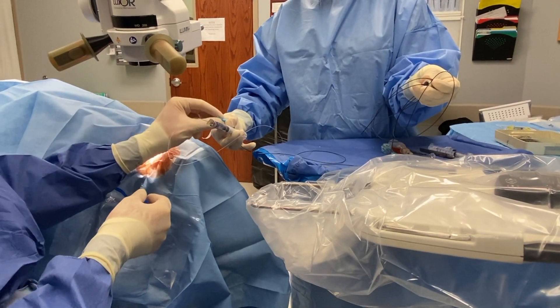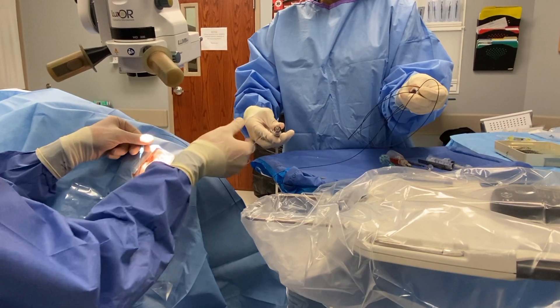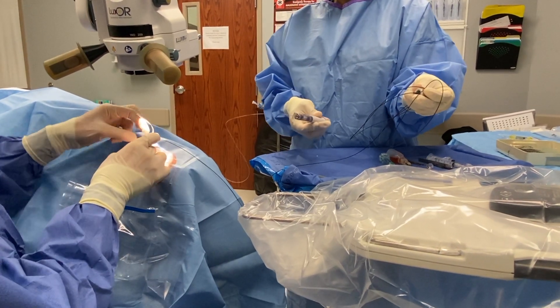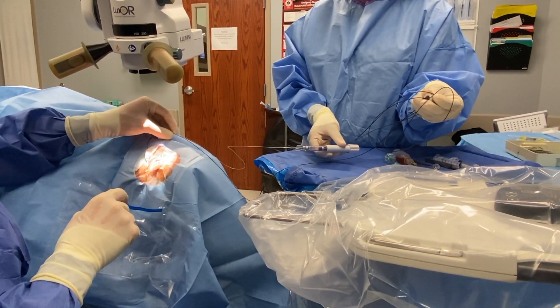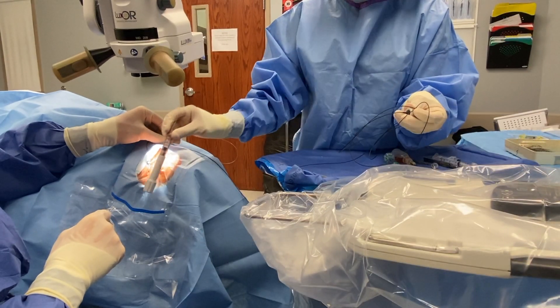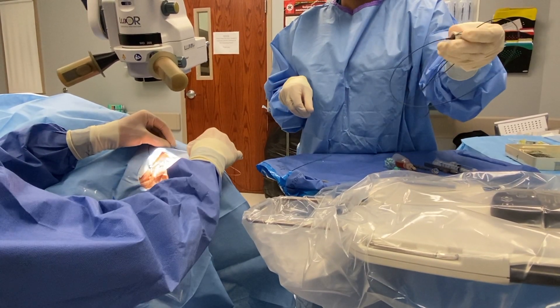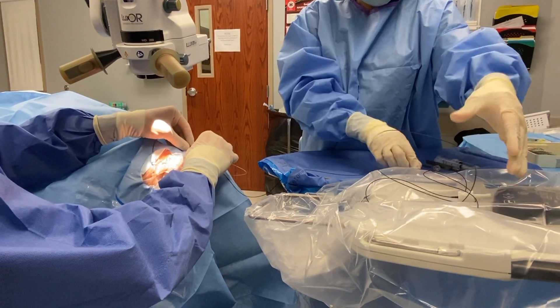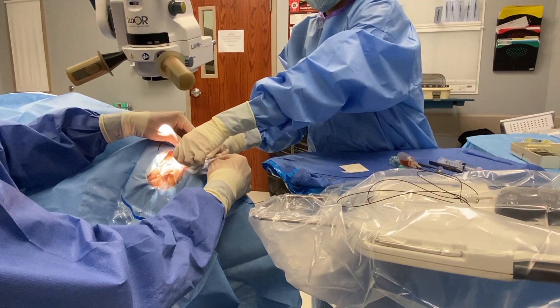As the eye track is passed onto the surgical field, the blue hub is first secured to the patient's brow or cheek. A stereostrip on the assistant's glove can expedite this maneuver. The viscoinjector is then laid either on the mayo stand or in the pouch of the phacoemulsifier or the patient drape. A second stereostrip can then be placed to secure the fiber optic cable and infusion line.